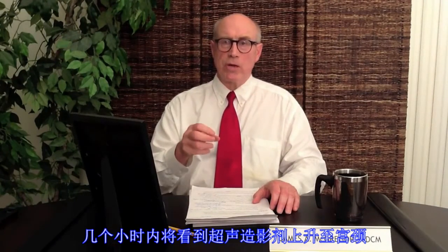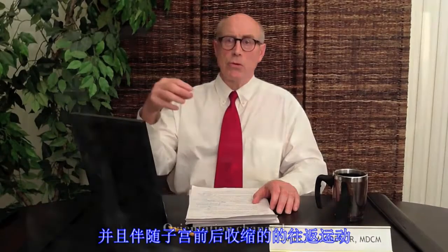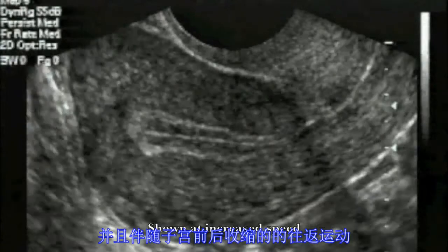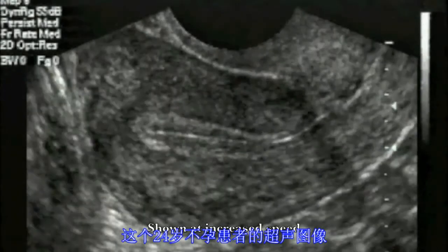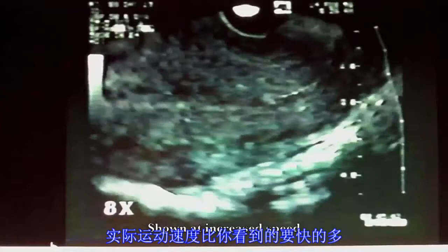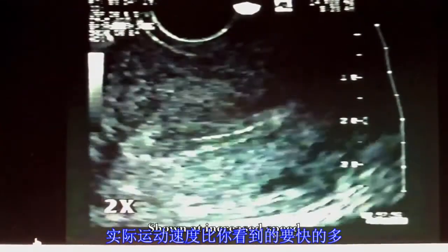where the ultrasound contrast media readily ascended through the cervix, and then there's a to and fro motion corresponding to the antegrade and retrograde contractions of the uterus. You can see it going back and forth, and this is readily seen. In these images of this 24-year-old infertility patient, these are actually sped up, so this is faster than you would normally see it.